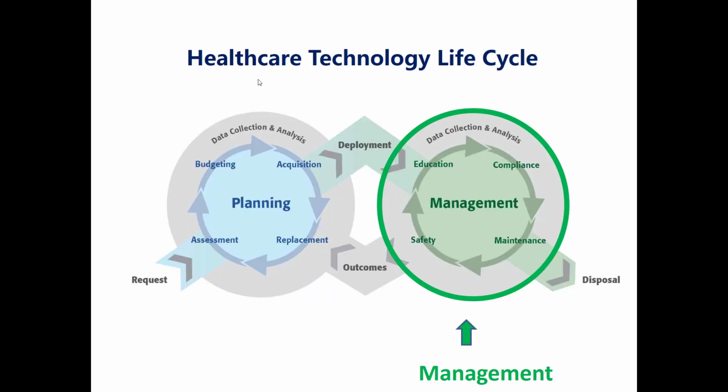This video will be about the second part of the healthcare technology life cycle, the management part. The healthcare technology life cycle will be separated into two main parts, the planning part and the management part. The bridge between them will be the deployment phase, and the outcomes will be used as feedback for the planning part from the management part.